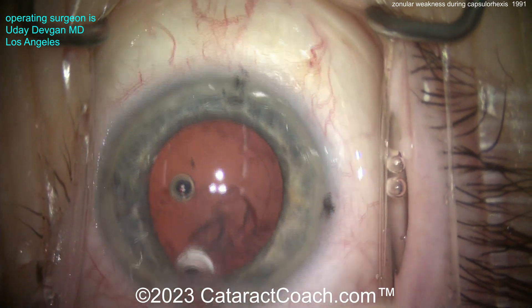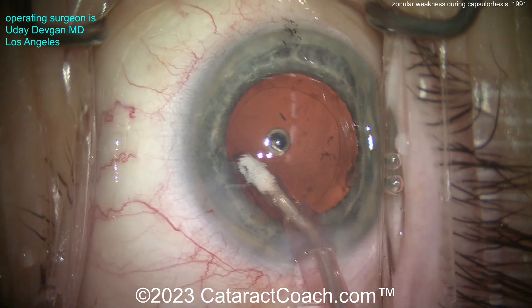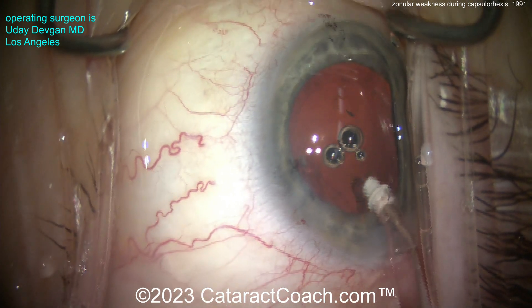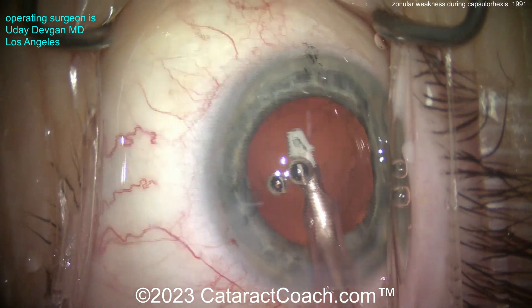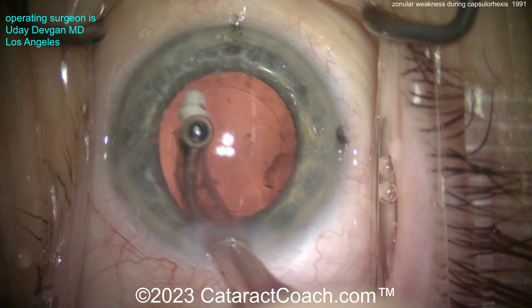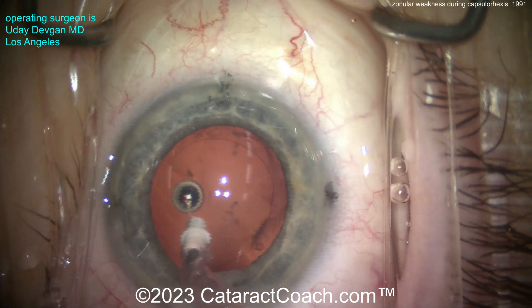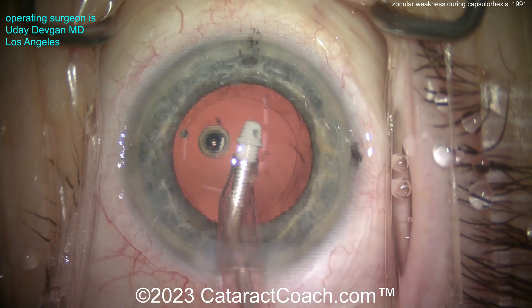I'm still debating whether to put in a capsular tension ring or not. I don't think I really need it. There was weakness of the zonules evidently at the beginning with the radial wrinkles of the lens capsule, but here it's pretty good actually. There was no movement at all during cortex removal, and I cleaned up the bag pretty nicely.